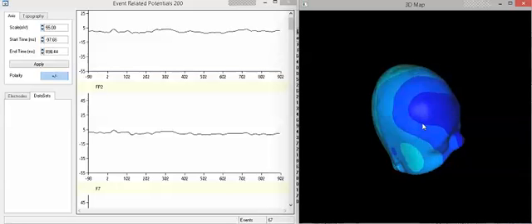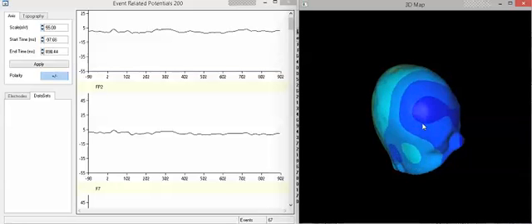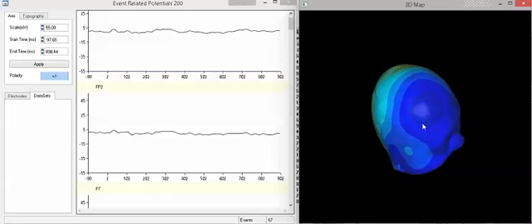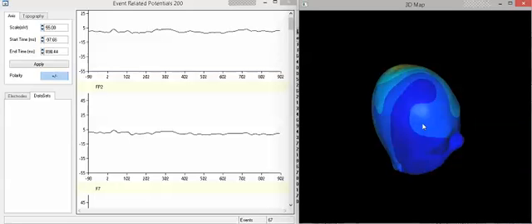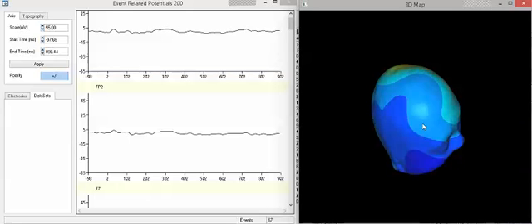And also, as I mentioned, to go deep inside and actually remove the scalp mathematically and look at the surface of the neocortex and link that to particular gyri involved in the evolution of the evoked potential. So this is what we're seeing.